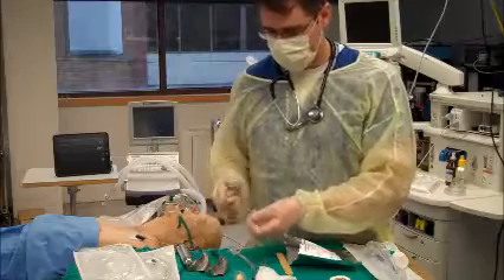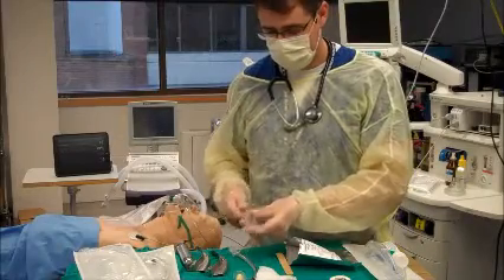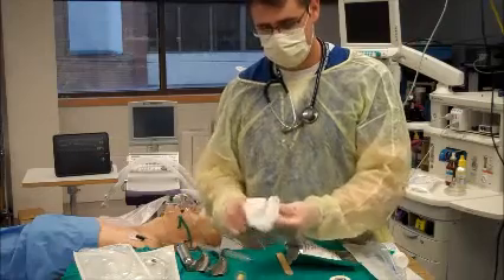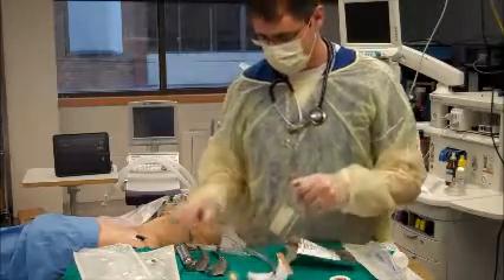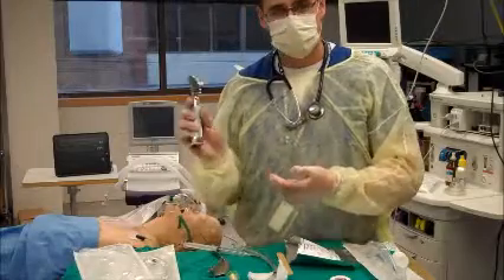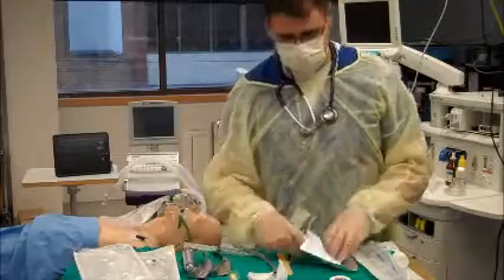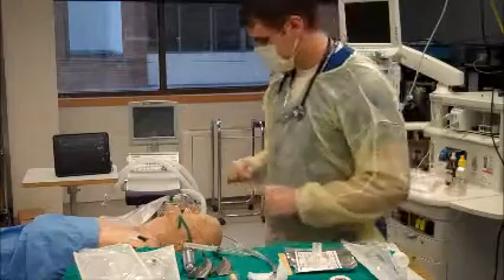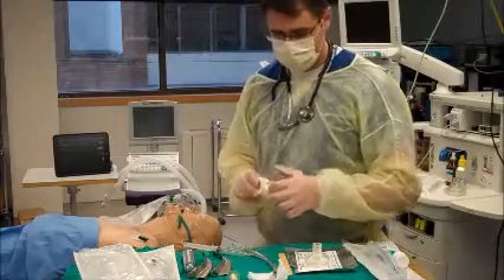Get my cuff inflator on, give the distal tip a bit of lube so that it passes through the cords easily, try to keep this as clean as possible, check again the function of my laryngoscope, open up my package and get my CO2 detector, and get some tapes ready at this time.